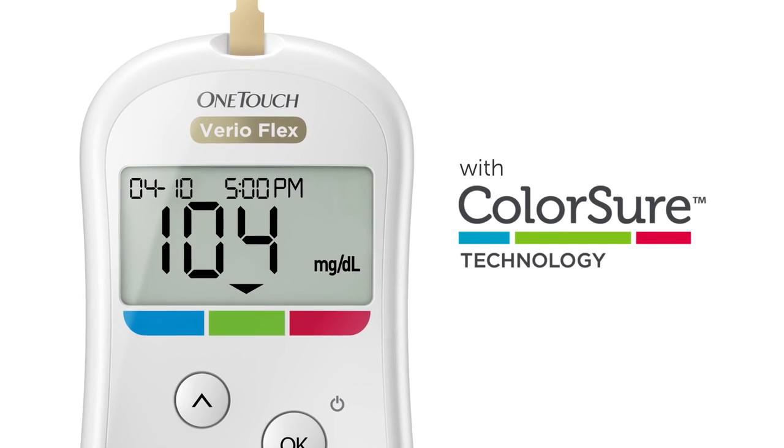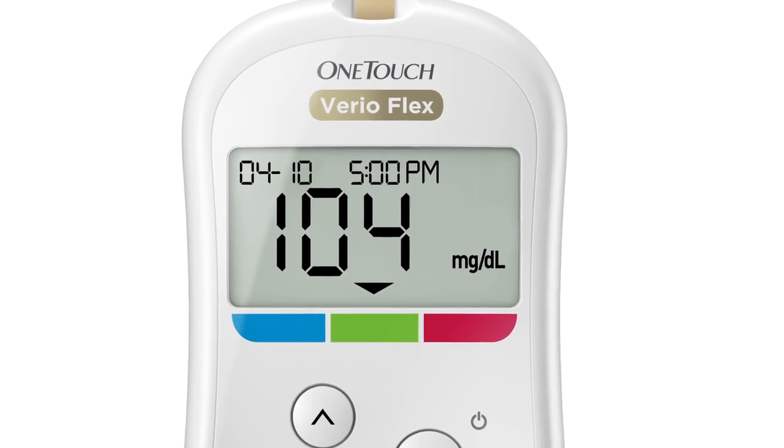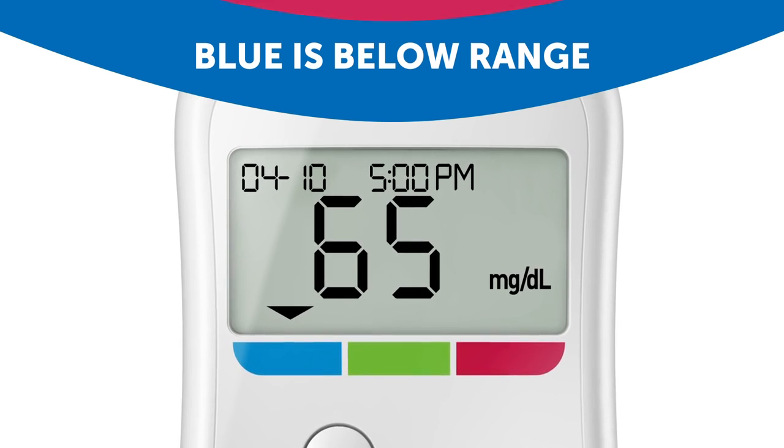With ColorSure technology, you can instantly see when you are in range, below range, or above range.